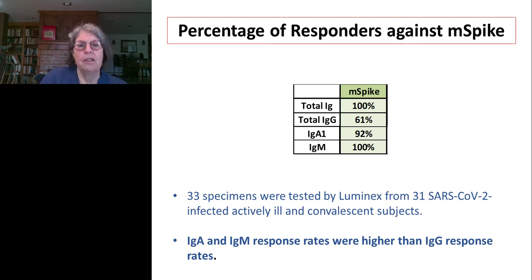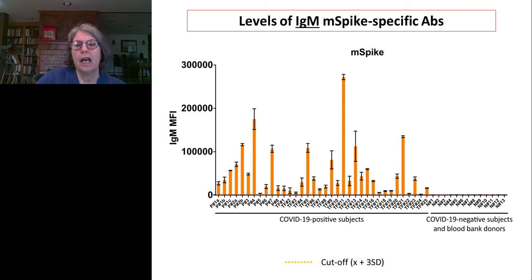For example, if you use an anti-IgM secondary antibody, you can look at all of the patients, as we did here, and we can say that the patient with the highest spike, relative to other patients, was the most robust responder in terms of IgM. But the level that you read probably is quantitatively different than you would get with an antibody against, say, IgG1.